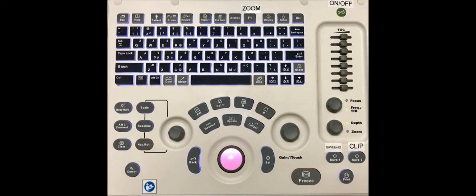Auto gain, or iTouch on this machine, is accessed by pressing down on the gain button. Overall gain on the screen can be increased by turning the gain button clockwise, and reduced by turning it anti-clockwise. Remember that increasing gain results in increasing brightness, but loss of contrast. Below the gain knob is the freeze button. This is used for freezing an image, for either closer inspection or for saving.